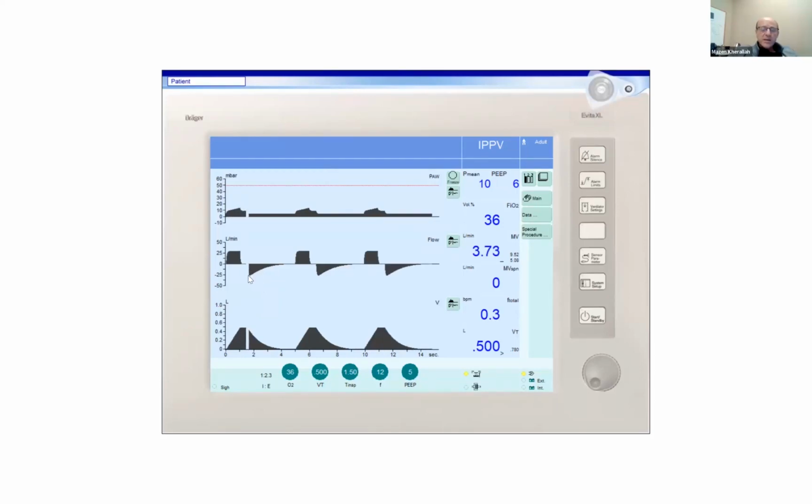So you can see this is a peak expiratory flow. 2/3 of it would be here. That would be the time constant. This is the time that is required to exhale 2/3 of the air. In order to empty the air completely from the lungs, you would require 3 to 4 times the time constant. So it would be a long expiration to exhale the remaining 1/3 of the air. Now, the time constant is resistance multiplied by compliance.